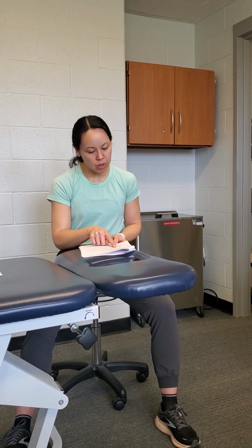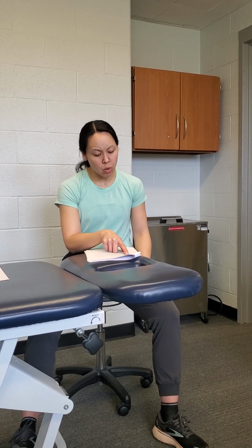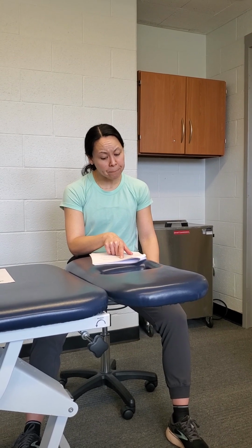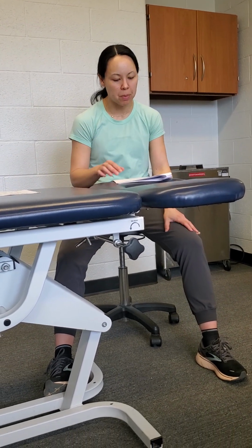There are a few different studies that he talked about, but generally it's pretty safe. This one study by Noyes in 2021 started at about 3 weeks post-op, but some studies are recommending as early as 2 days post-op. So if we're seeing that patient in the first week post-op and they're in a lot of pain, or they're just not moving well, do the BFR even passively, and that can help with muscle sparing quite a bit.